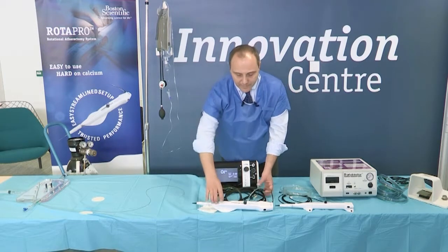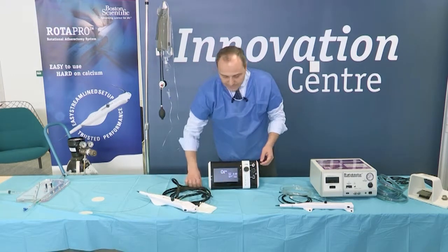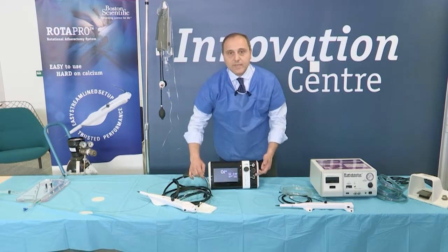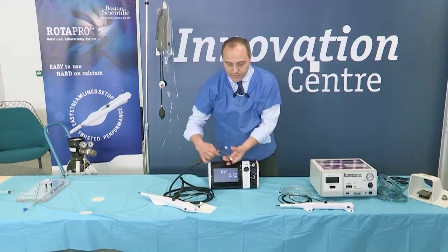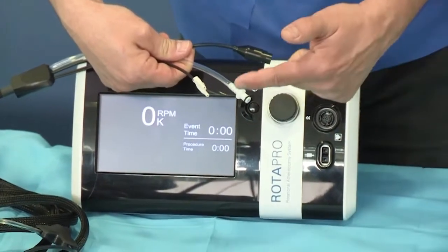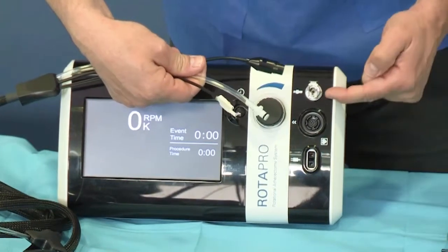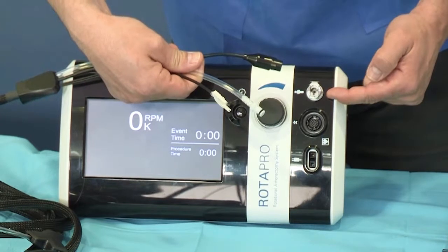As I mentioned before, the connection between the advancer and the console has been made much easier for the cath lab staff. And if we just look at the advancer, we can see that there is no way we can make mistakes in doing the connection, as the ports for the cables have been made so different and so unique that anyone can do this connection without mistakes.